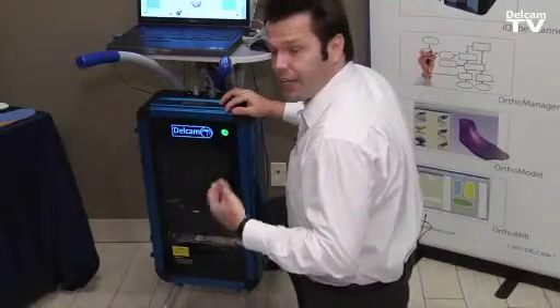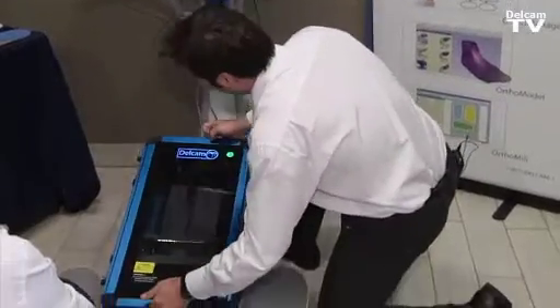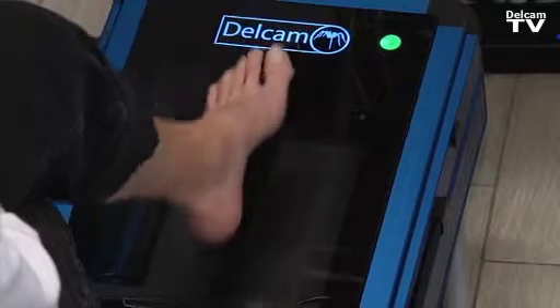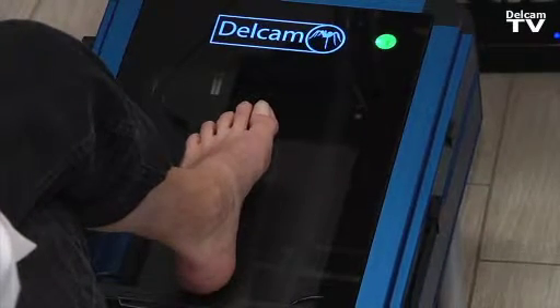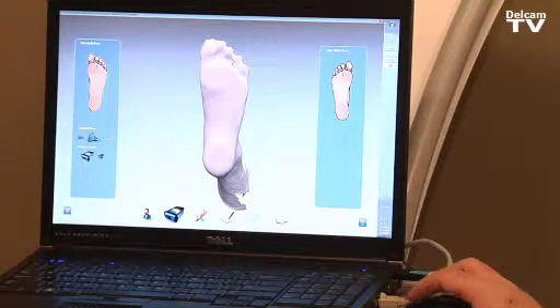From non-weight bearing, we can also do semi-weight bearing scans by simply detaching the scanner and moving it into the semi-weight bearing position. For the semi-weight bearing, the patient positions the foot on the scanner and the practitioner can align and hold the foot in position, then simply click to scan either the left or right foot.